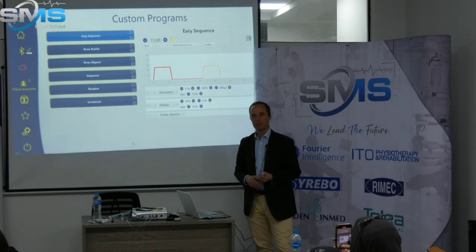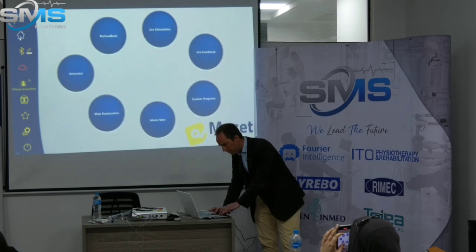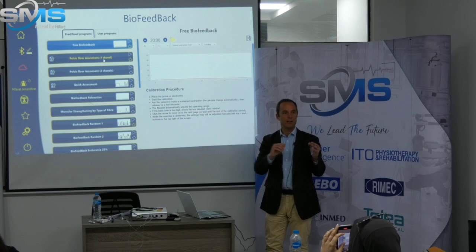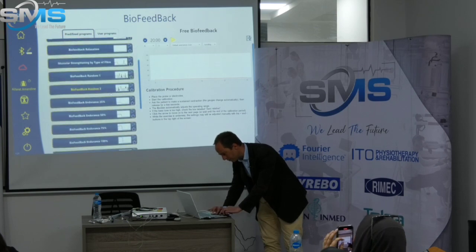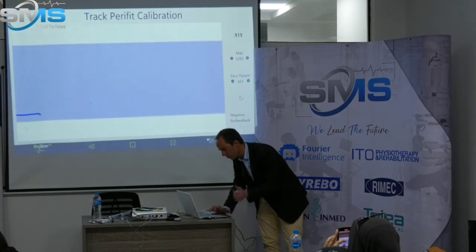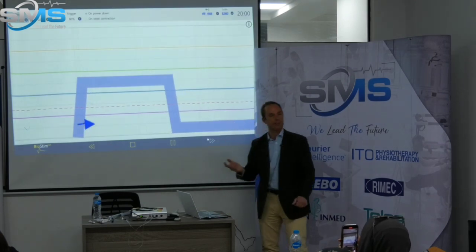Combined programs can also be used in another context. If you have a patient that during the session gets tired very fast. So we've seen that we can make the exercise easier, but we can do better with this. Here, we can ask an assisted biofeedback. So when I start, again, my patient now controls pelvic floor perfectly, but she's getting tired very fast.